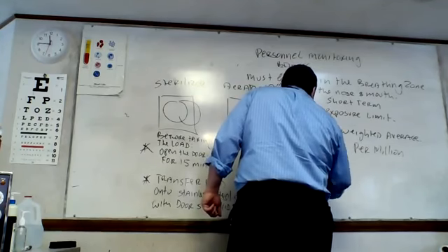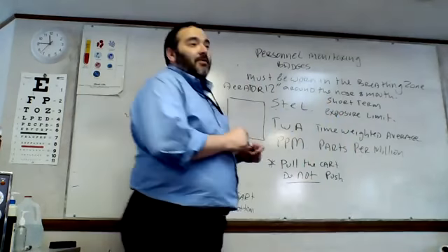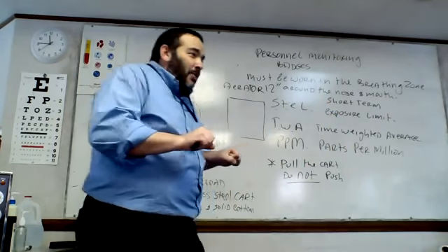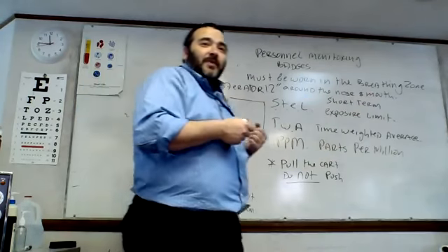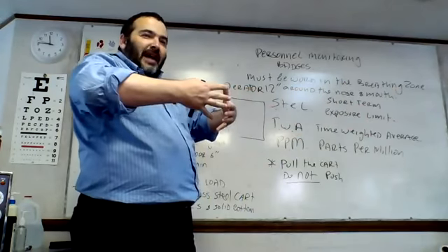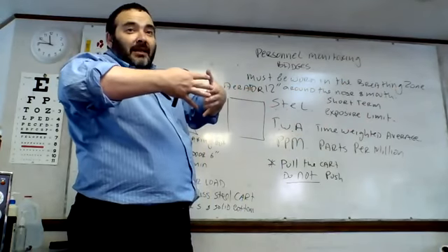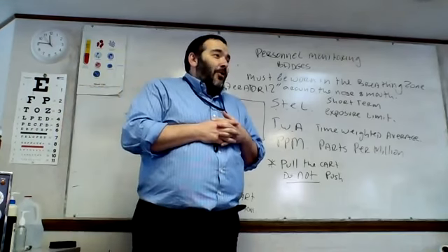Do not push. Why? Because as you push something, it aerates the stuff into you. The air cycles through your load, and if there's any residual ETO, it's going to be in your nose.